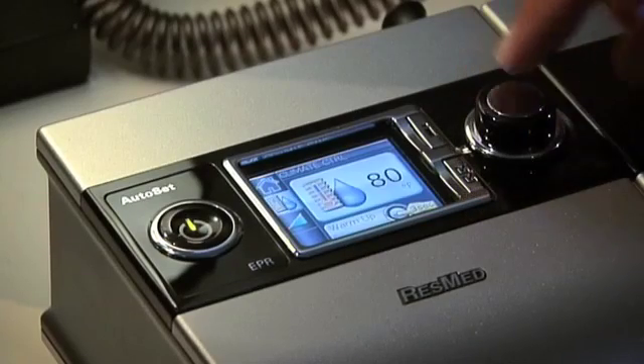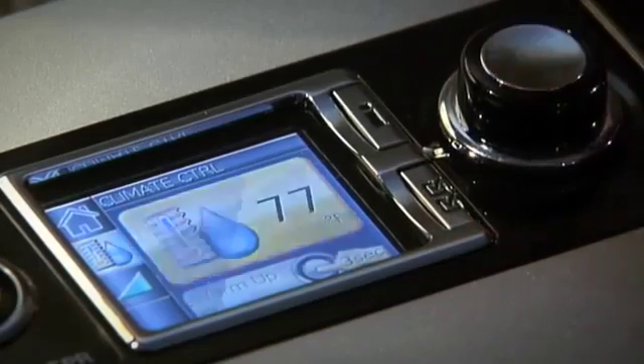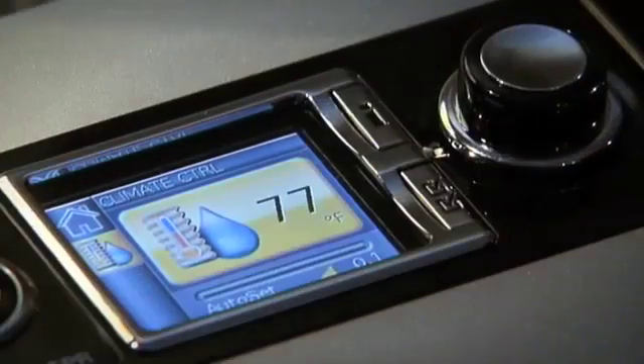So you can literally dial in the temperature. And fairly quickly you'll feel that temperature change at the mask, and you can just adjust it to something you're comfortable with.